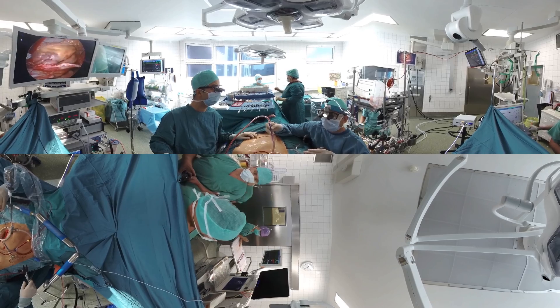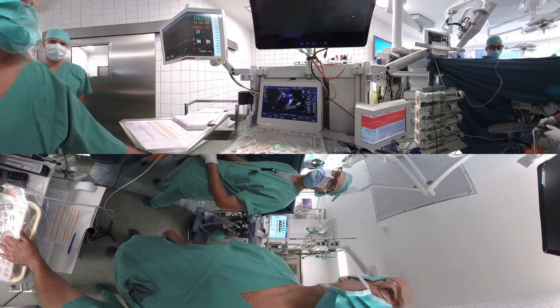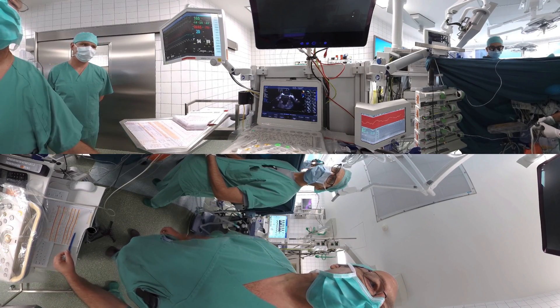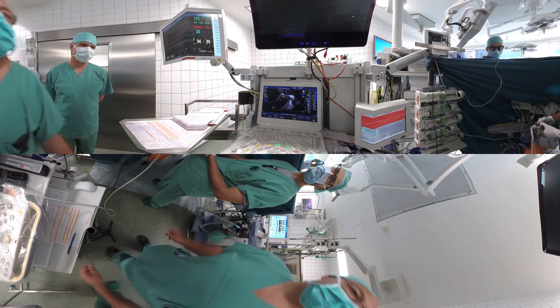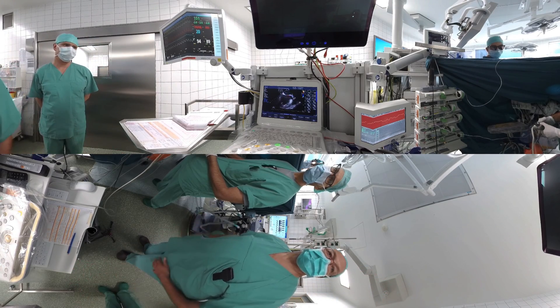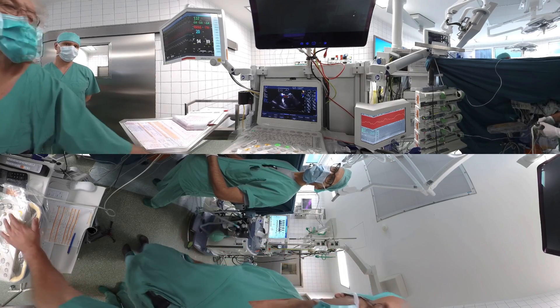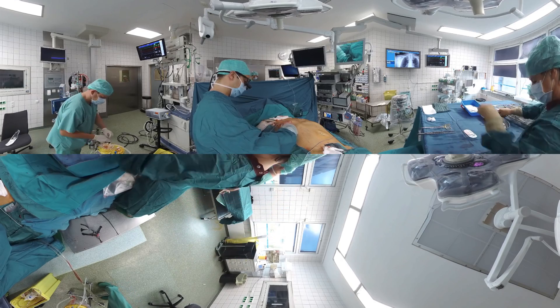Normal blood flow is now re-established to the coronary arteries and the heart starts beating once again. The heart-lung machine is slowly weaned and the circulation is once again taken over by the heart. Trans-esophageal echocardiography is used to confirm the operative result. In this case we see a perfectly competent mitral valve with normal cardiac function.